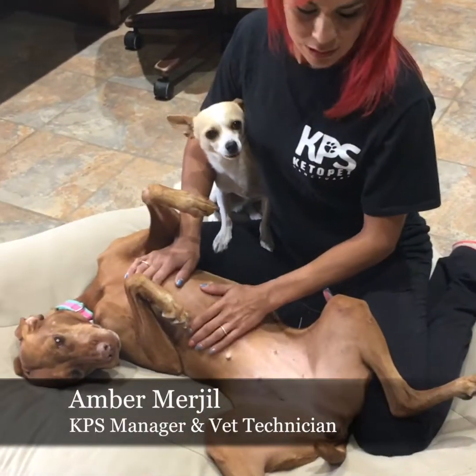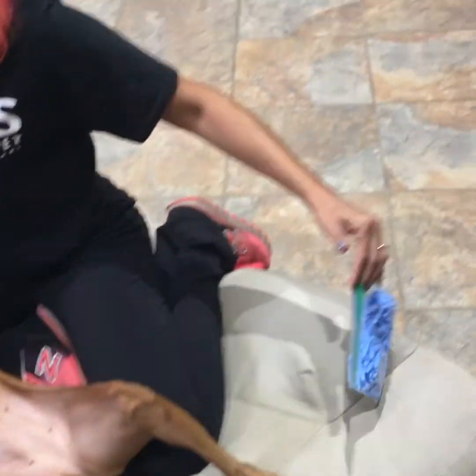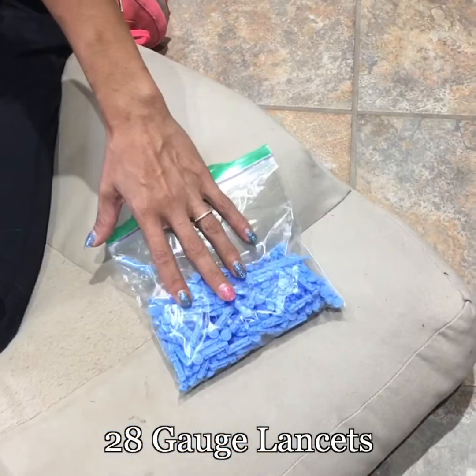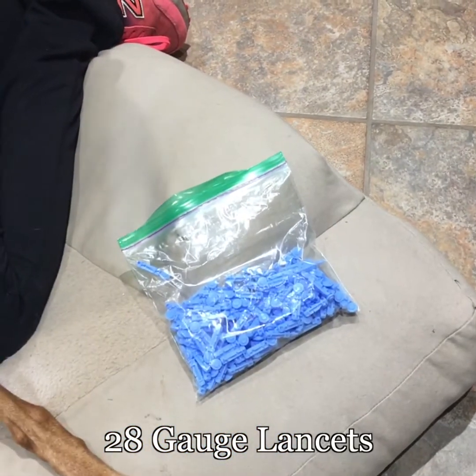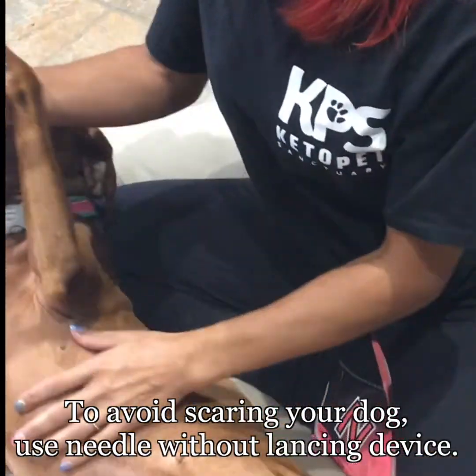Most glucometers come with a 30 gauge lancet, but I recommend 28 gauge. Dogs have thicker skin, so the 30 gauge is really small. I like to use bigger ones because dogs have thicker skin.